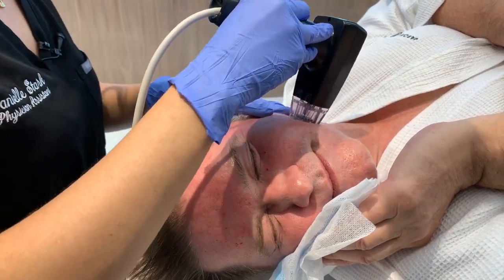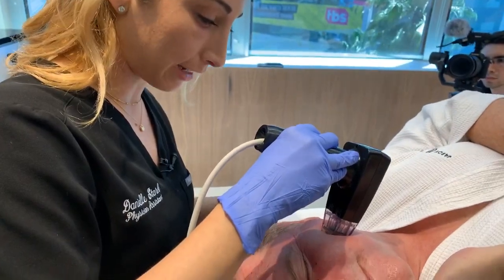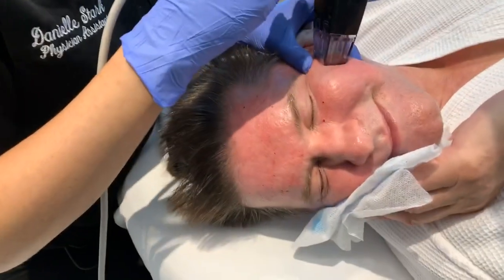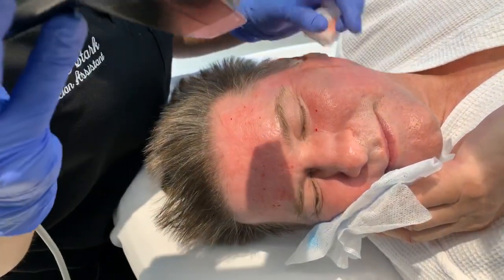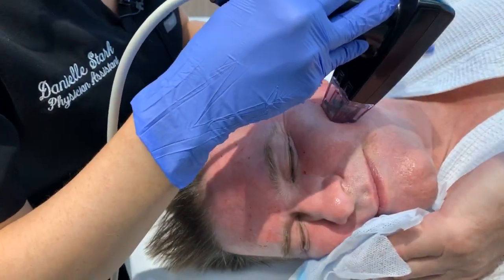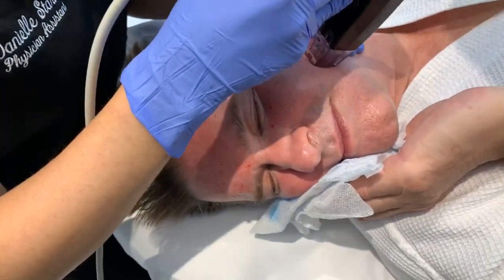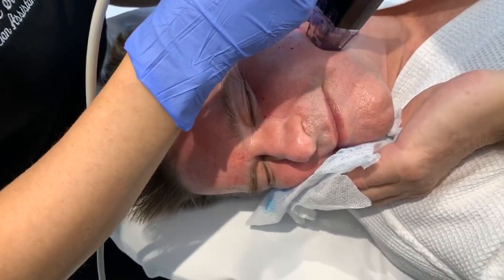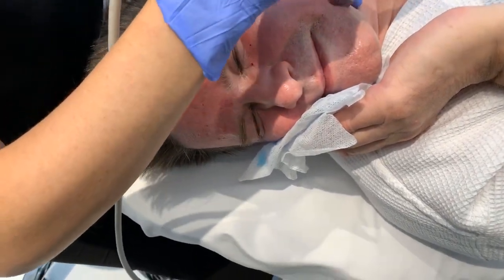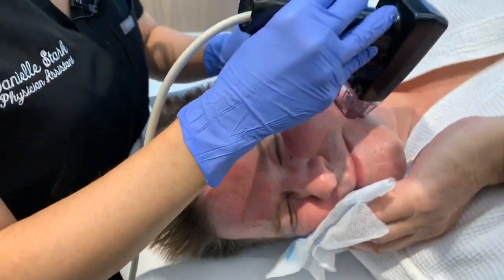I would say that you're really only maybe a little bit pink for one day. Like the next day you have some very, very pinpoint little baby scabs, which on a man's face with all the hair follicles, you can really hide them quite easily. But even for a woman, it's not very noticeable, so the downtime is quite minimal. And in about a week, you're well healed and just kind of glowy. And by 3 weeks, your skin has really remodeled quite nicely, and it's looking much tighter, much smoother.